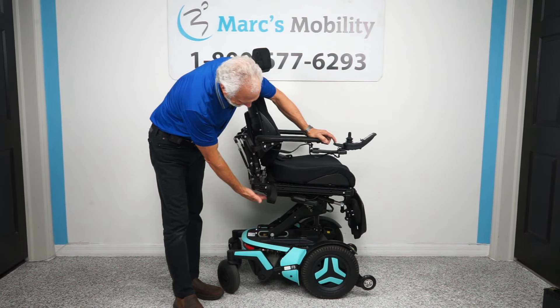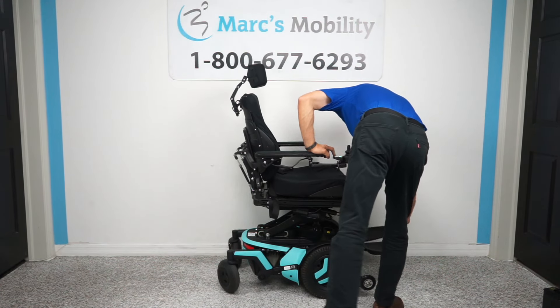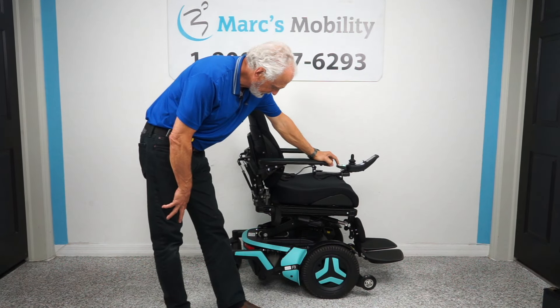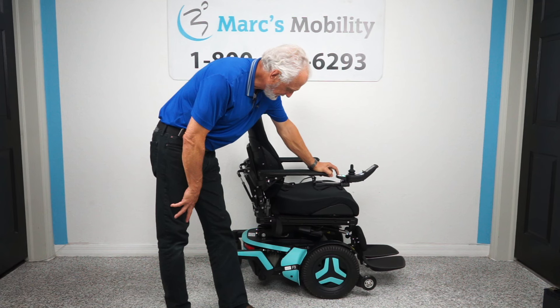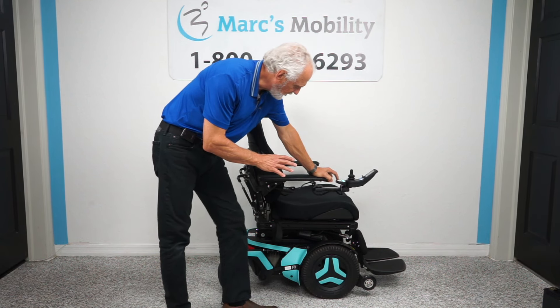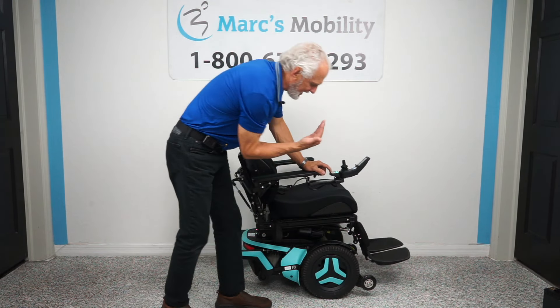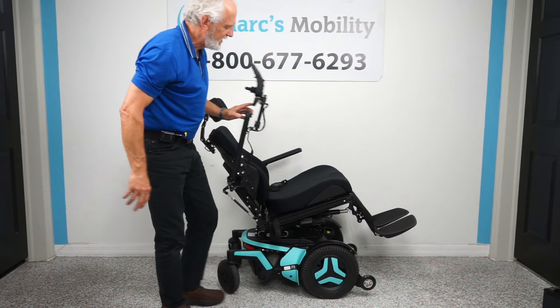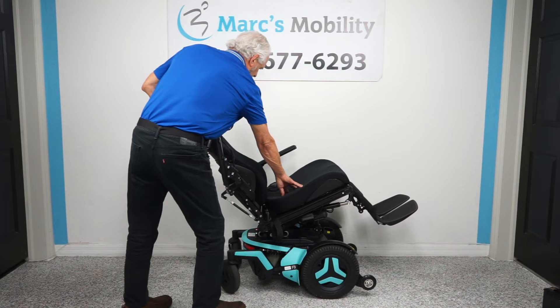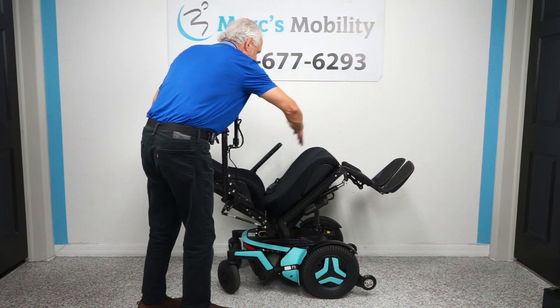I'm going to bring the anterior tilt back down, bring the seat lift down, and put the foot plates back down. The next function is called the electric tilt — this is when the base goes back, taking the legs and the back with it, as they're all connected. This is good for relieving pressure off your bottom and back, and it has a lot of good medical benefits — you can also improve circulation in your legs.